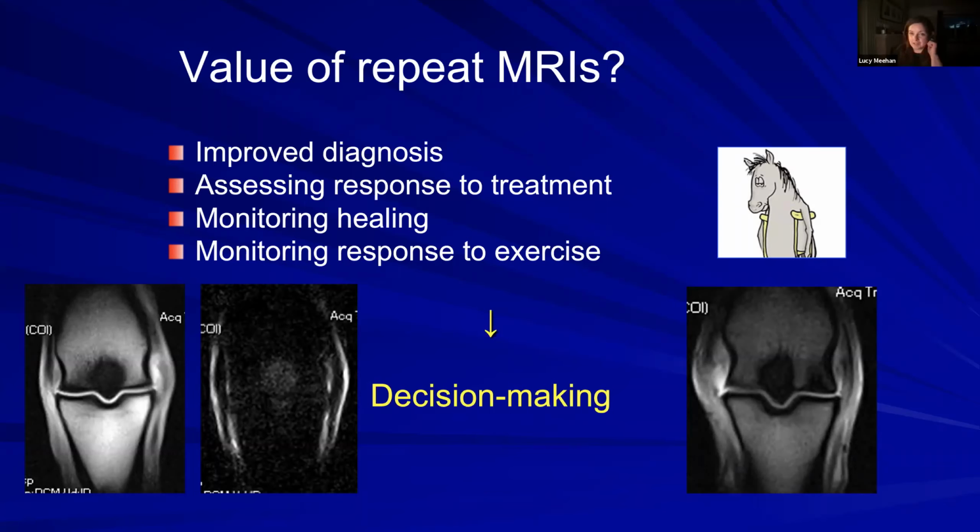Yeah, I think it's interesting, and certainly there's been some work, hasn't there, looking at congruency of the joint in a sagittal plane, but I don't know that anyone's looked at it in a frontal plane, which might be quite interesting to maybe have a think about in these cases.